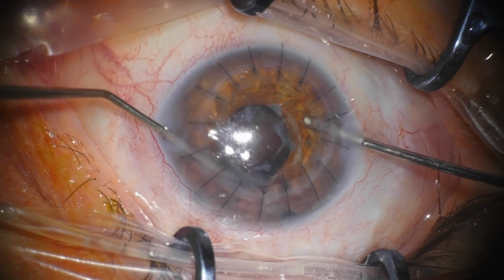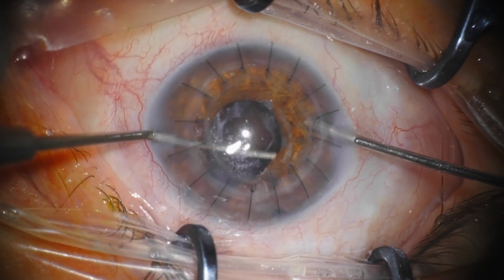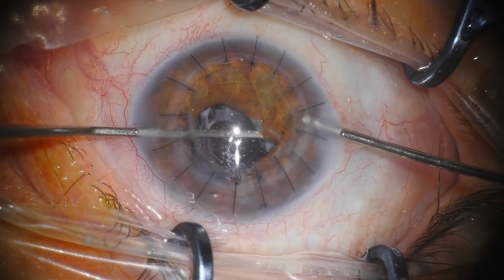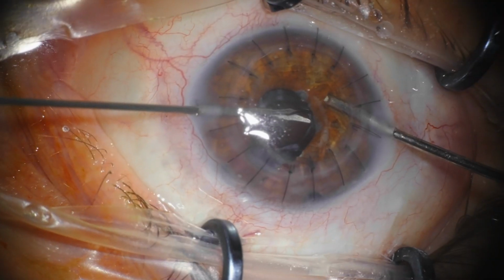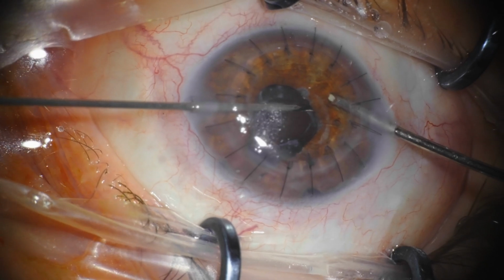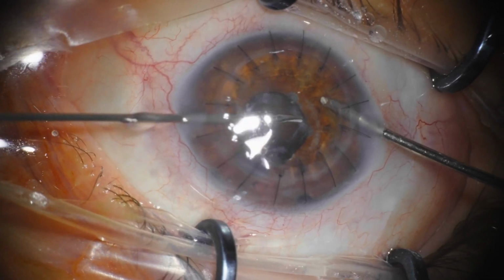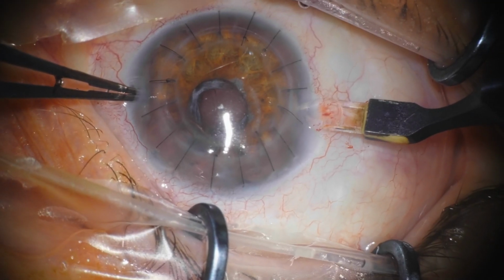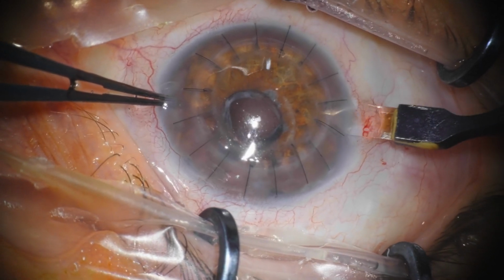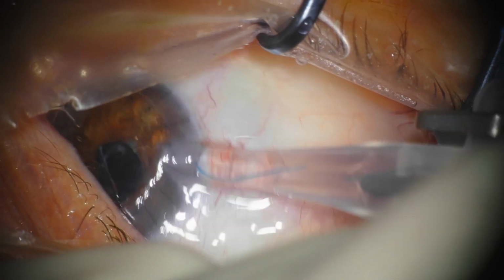So he also had some vitreous coming out from the back and through the defects in the capsular bag, and also, as is often the case in trauma, there is a lot of posterior synechia that we need to lyse and sometimes even cut with intraocular scissors, simply because the adherences are too strong, and you wouldn't want to rip the bag, because in this case we want to use the sulcus as a means of 3-piece IOL implantation.